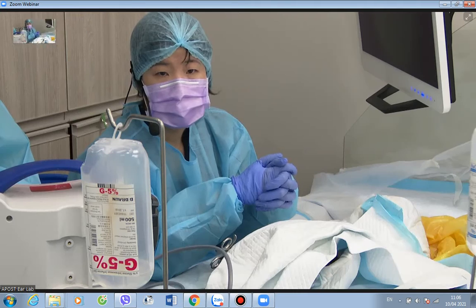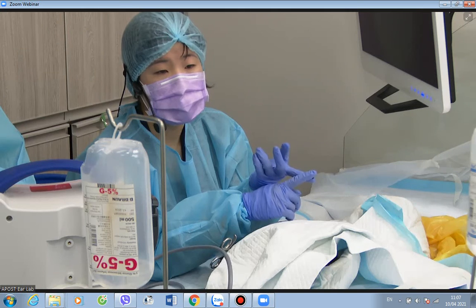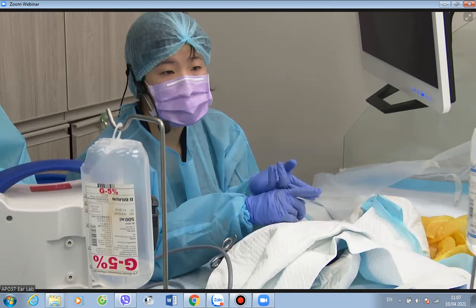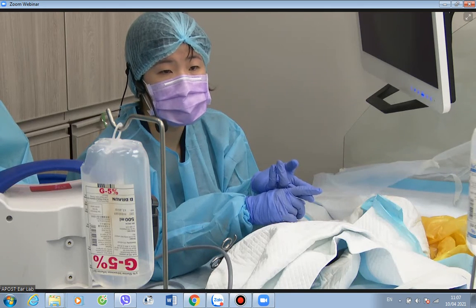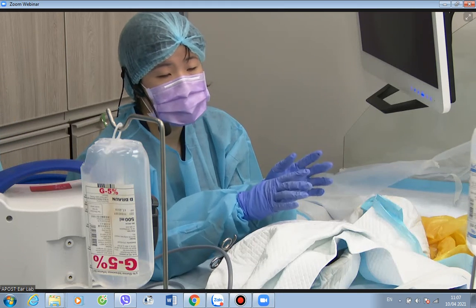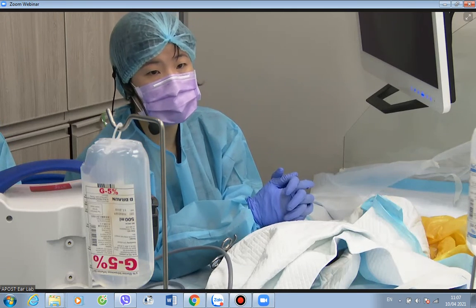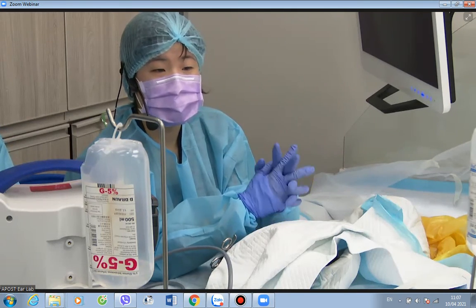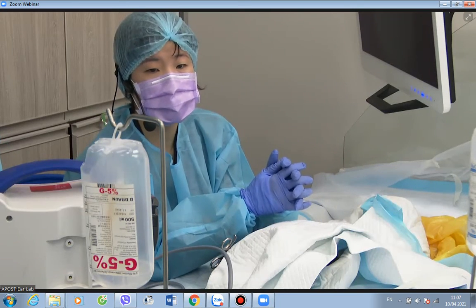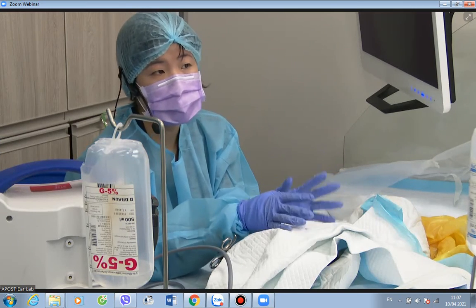And so hopefully you can get some basic idea. Number one, how we can use the microscope and endoscope together, and the anatomy of the middle ear, the facial nerve, the inner ear, the vestibule, and you take much more time when you go in the IAM. So if you have a hands-on later on, join us, because we will have more time, and you have hands-ons where you can appreciate more anatomy on your own, and you can have various approaches.